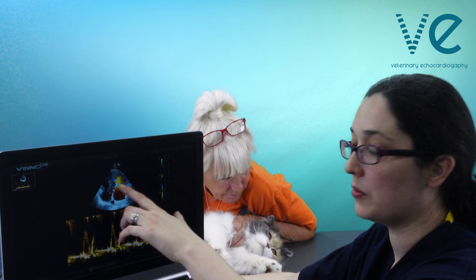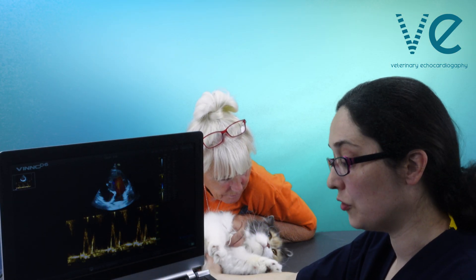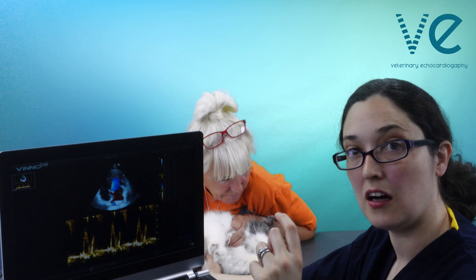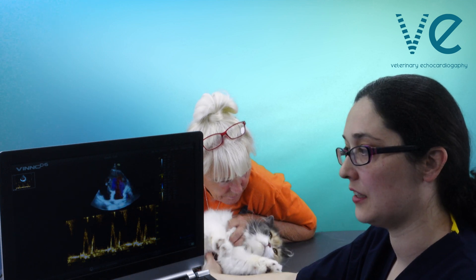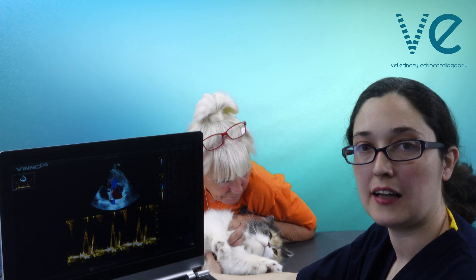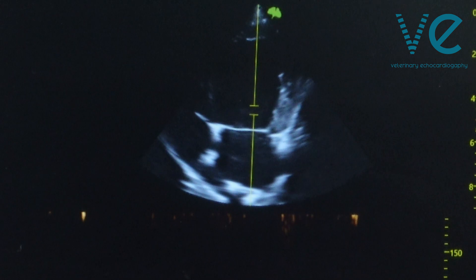Notice that my sample gate is nice and small. You don't want a really large sample gate as you get a very noisy signal. In cats it should really be as small as your machine will allow.